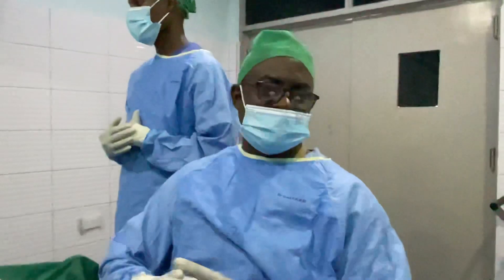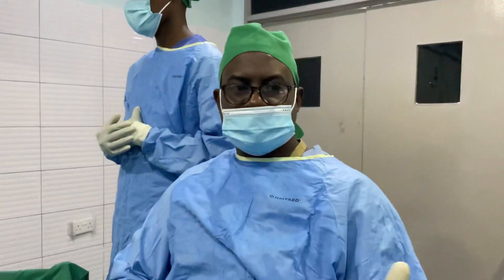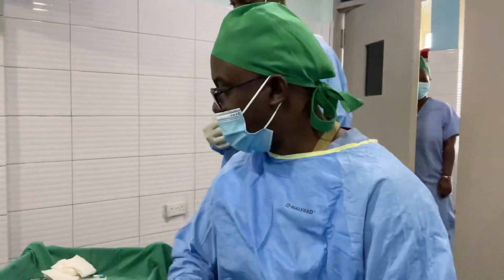You also need the camera, the light source, and the other gadgets as used in hysteroscopy.